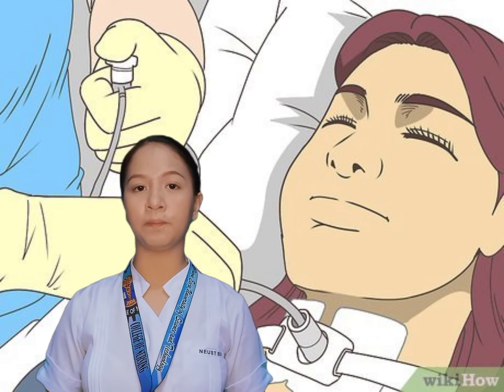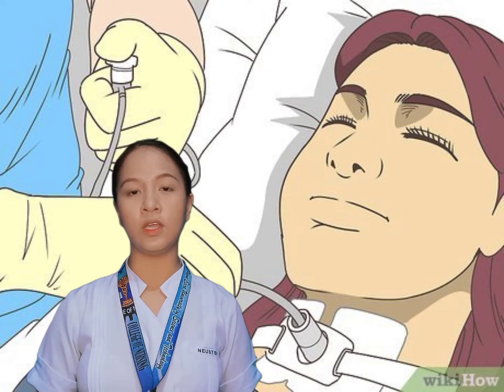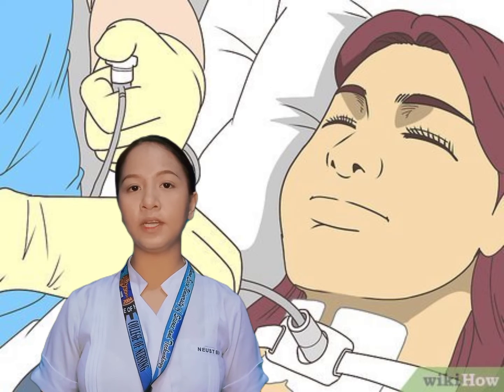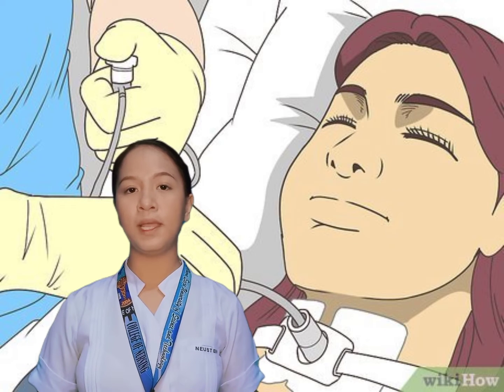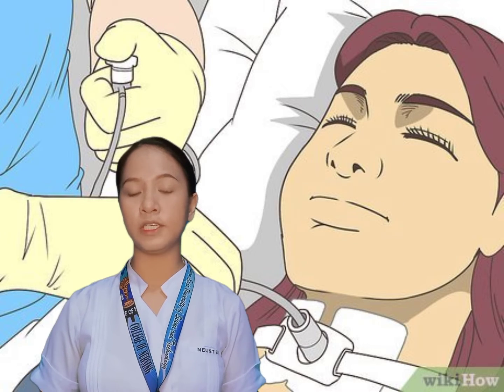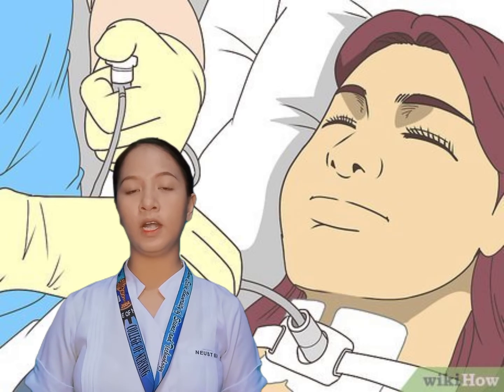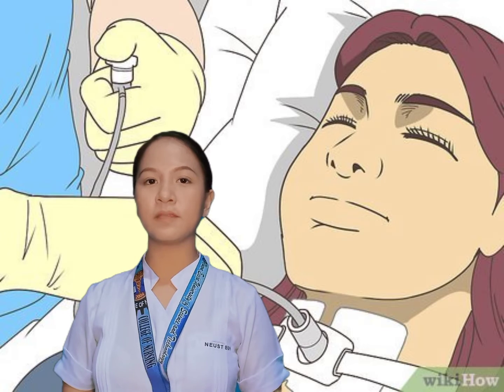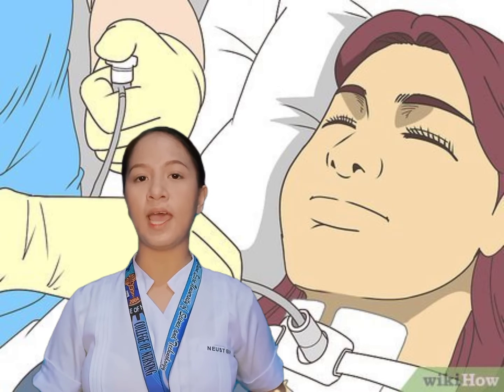appear to be alert. Next, adjust bed to comfortable working position, usually elbow height of the caregiver, lower side rail closest to you. If the patient is conscious, place him or her in the semi-Fowler's position, and if the patient is unconscious, place him or her in the lateral position facing you. Next, move the overbed table close to your work area and raise to waist height.